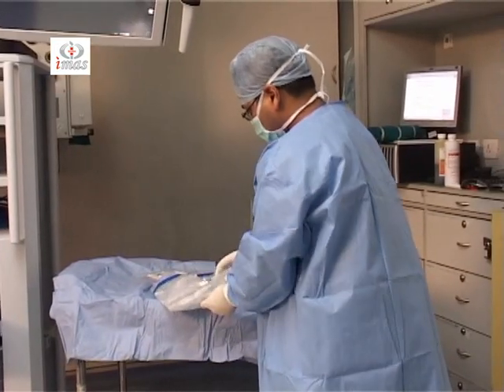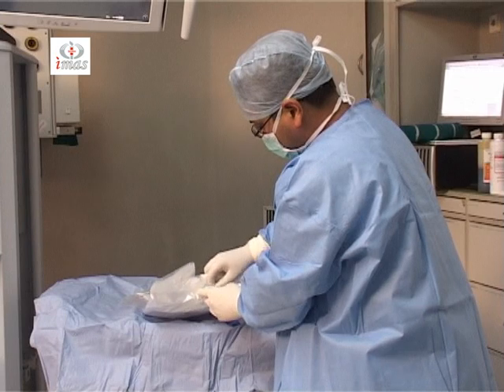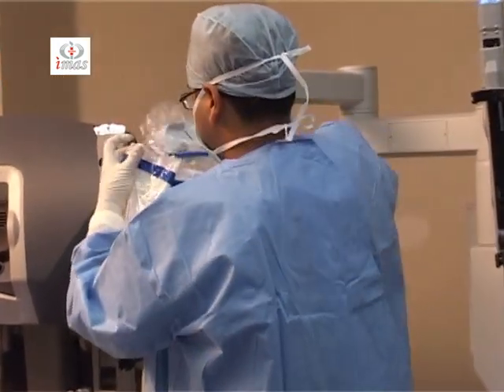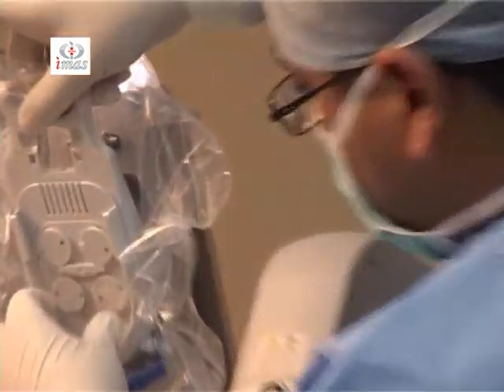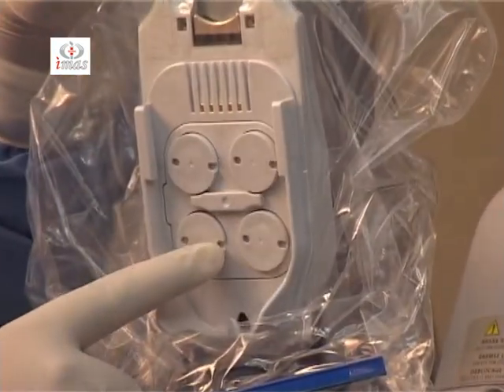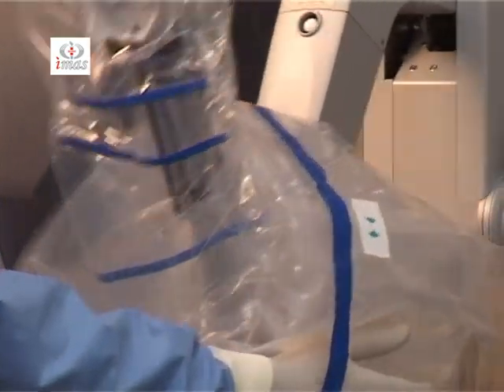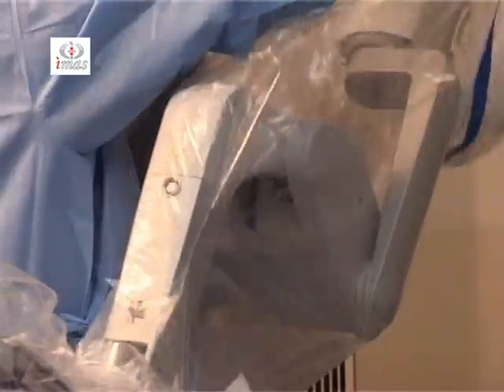These are opened up, and after opening out this, just hold the instrument arm sterile adapter erect and place it onto the instrument arm. The sterile adapter has to come here. After it has been placed nicely, you can see the pulleys are rotating and they can be pressed easily, so they are well placed. Now, by pressing this button, you can make it into an optimum position and open up the drape.